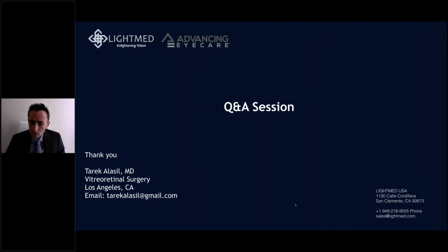So basically, focal laser is the laser that you do when you have a patient with macular edema. Focal laser means that you're applying the laser within the center part of the macula, which is where your central vision is. And it gets tricky when you're treating in this area because you want to treat the swelling, but you don't want to cause destruction of the valuable photoreceptors present in this area, because they're in charge of your reading vision, when you focus, when you do detailed visual activities.